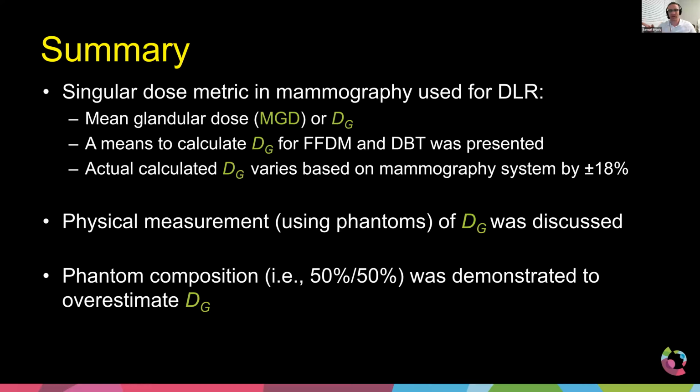And as we talk about in the next talk, all of our dose calculations have to be below a certain value. There's a threshold. And if the system is above that threshold, you cannot use the machine. I don't know to what extent Thailand has adopted similar standards. I know the IAEA basically has the same recommendations, so I assume Thailand's probably following the IAEA. And then you can go in and look at the values, and that 18% will tell you how you can adjust your outputs.